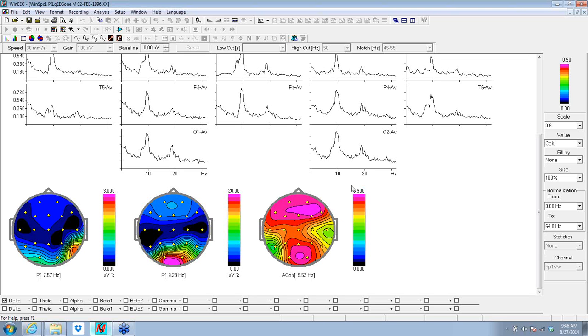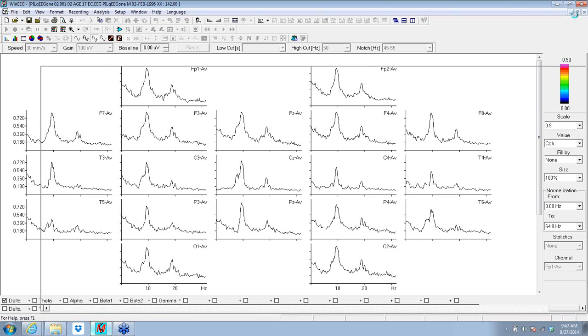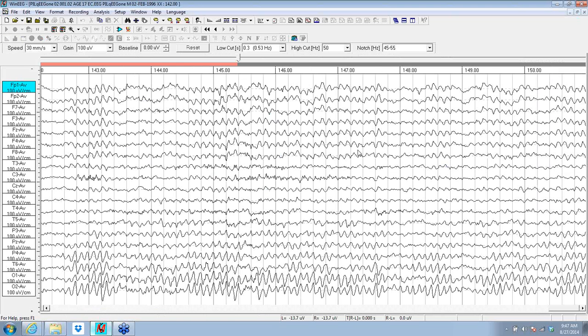Now, it can only go up to 1. When it gets up above 0.8, we almost have to start to think, is it some kind of an artifact? This is so high. And when we look at the raw EEG, we see this extremely stable frontal alpha. You've got two choices when you see frontal alpha like this. This could be coming directly from a frontal lobe source of some sort, and given how widespread and in sync it is, that could be the anterior cingulate deep along the midline. But this could also be coming as a field effect from the thalamus, from the posterior projections going in the opposite direction. So if this is a field effect, it would explain how curiously high it is.